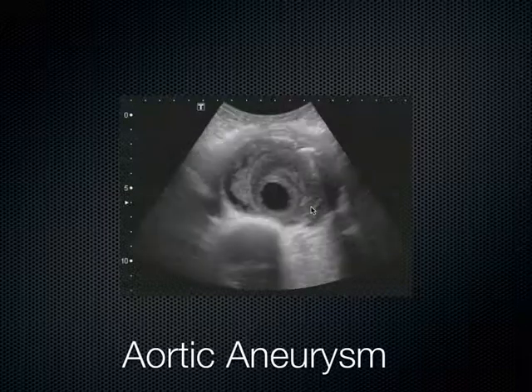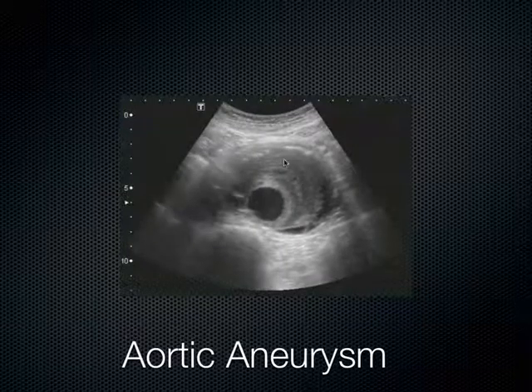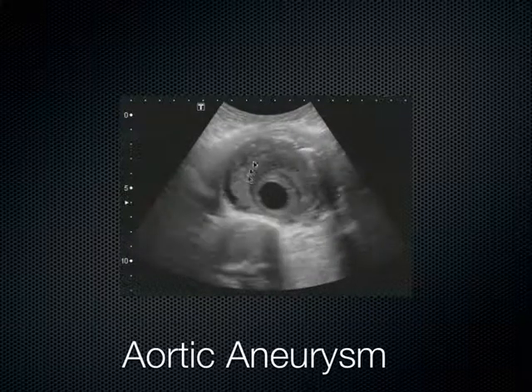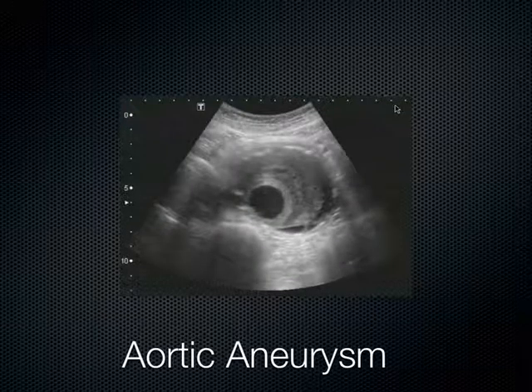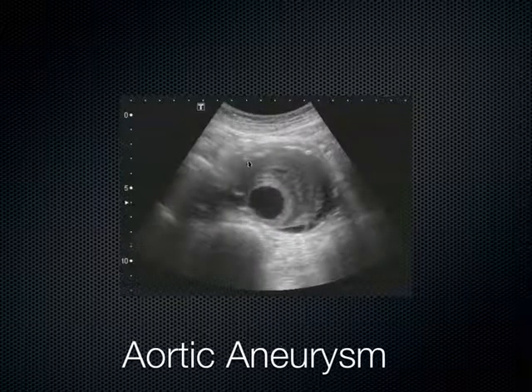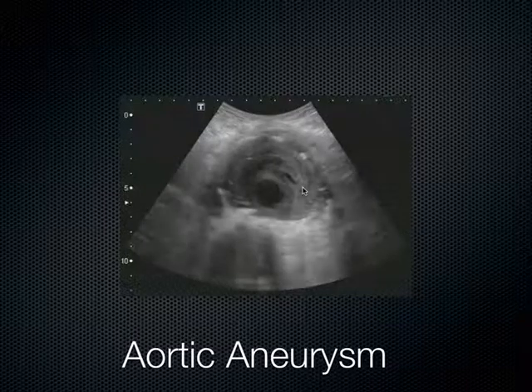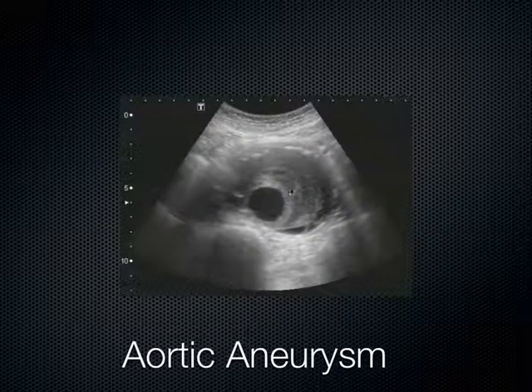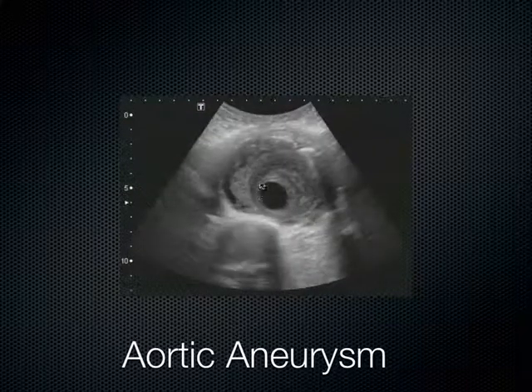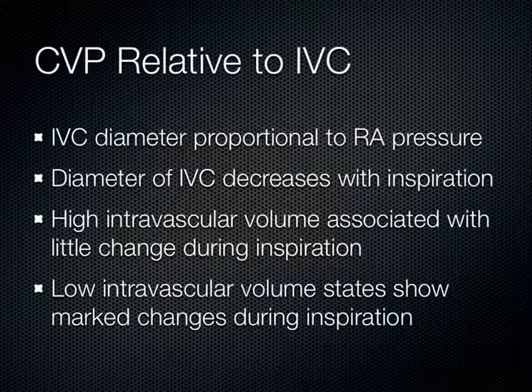And the reason you don't feel these on physical exam is because of all this clot right here. So this is the true lumen. This is all this congealed stuff back here. This is the clot. And you won't feel the pulsatility of the aneurysm on the physical exam because the clot dampens it, with all of this congealed material here. So yeah, it's pulsatile down here, but that doesn't transfer so much towards the skin line. So that's why we miss these on physical exam about half the time.